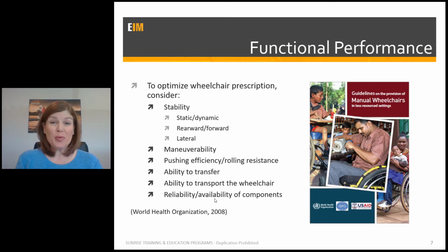Now, because this is a global webinar series, I thought that I would start with a global resource. The World Health Organization published their guidelines for the provision of manual wheelchairs in less resourced settings. And for those of you who are viewing this webinar who live in wealthy countries, you still might feel as though the particular area where you live and work is perhaps less resourced, in the sense that you're not able to provide everything in terms of manual mobility that you would like for your client through the funding source. And then, of course, there will be others of you who do live in less resourced settings.